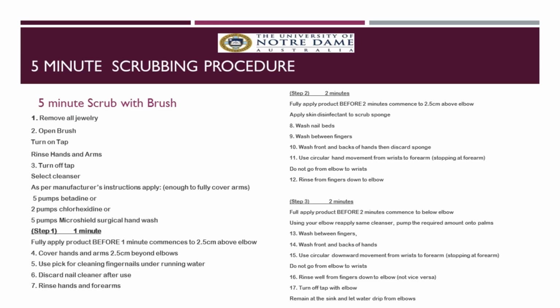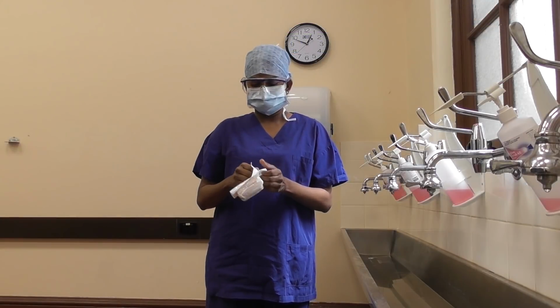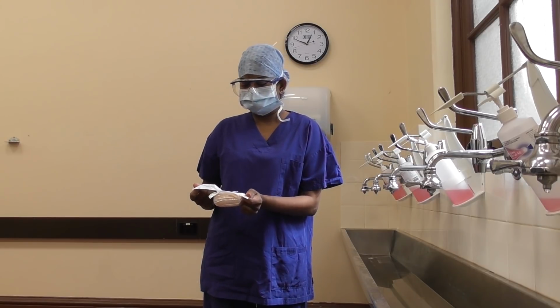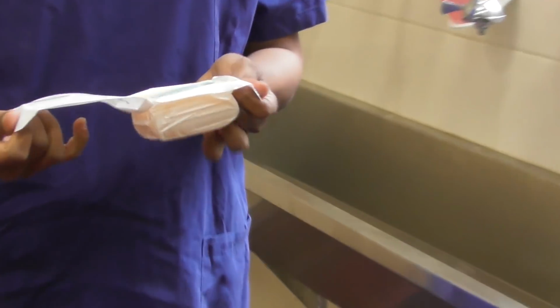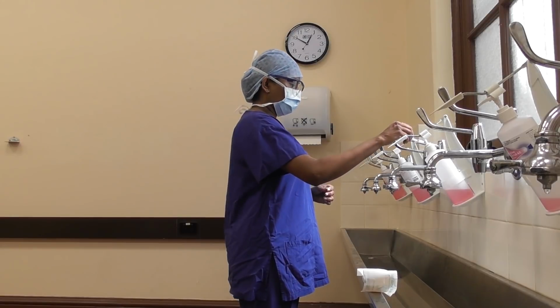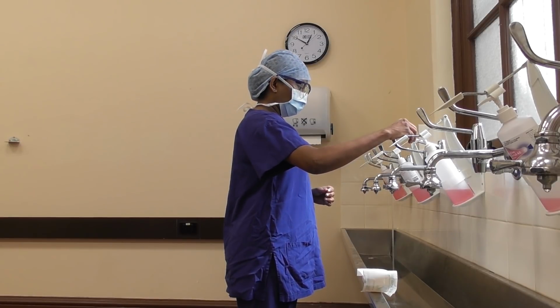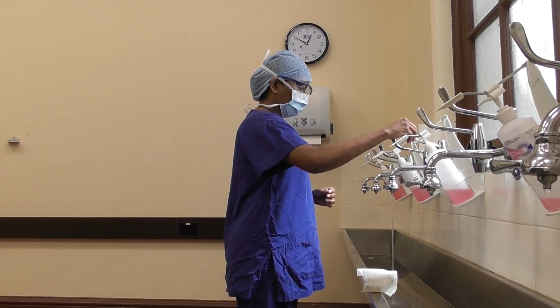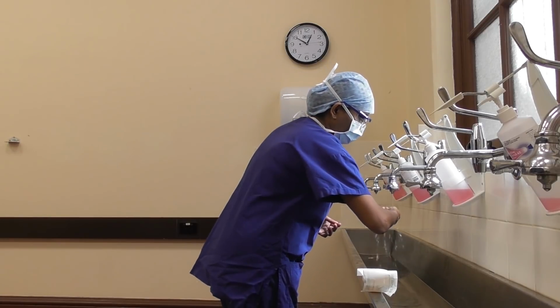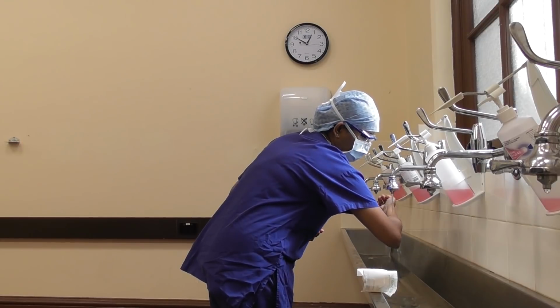Now I'll perform the 5-minute scrub. Open the scrub brush packaging carefully, making sure not to touch the contents. Fold the plastic under the brush and place it next to you. Wet your hands under running water past the elbow.